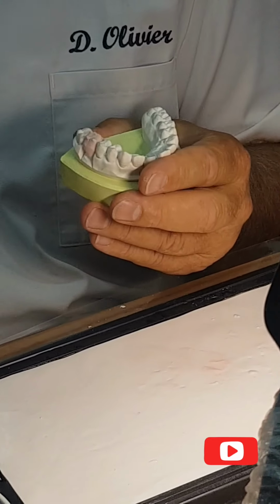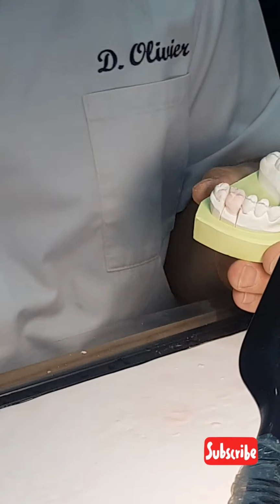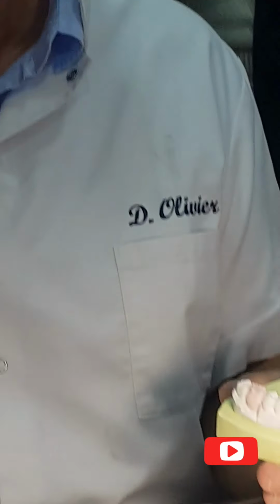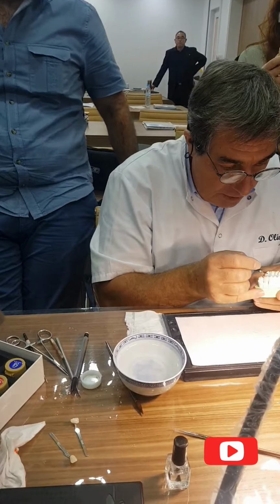Is this one concave in the posterior, and in the anterior also? Sorry? Concave, and anterior also? No, no, no. I will show you the anterior this afternoon when we build up two anteriors, one young and one old. You will see. But in the natural anterior tooth, the dentine is flat. Here it's concave. Look, you see the concavity? And now I just have to finish like that.